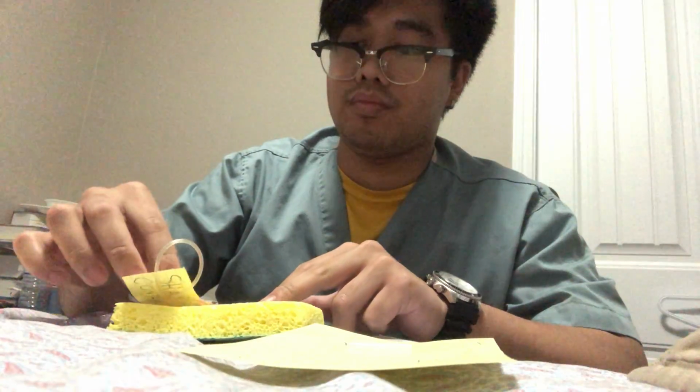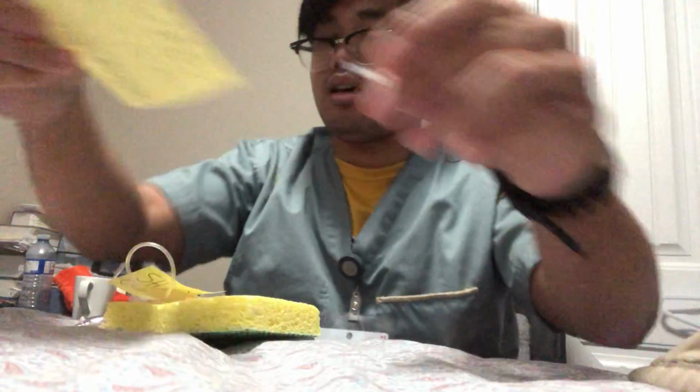There we go. Okay, now that I've done that, I have here in my bag, I have pre-primed my IV.